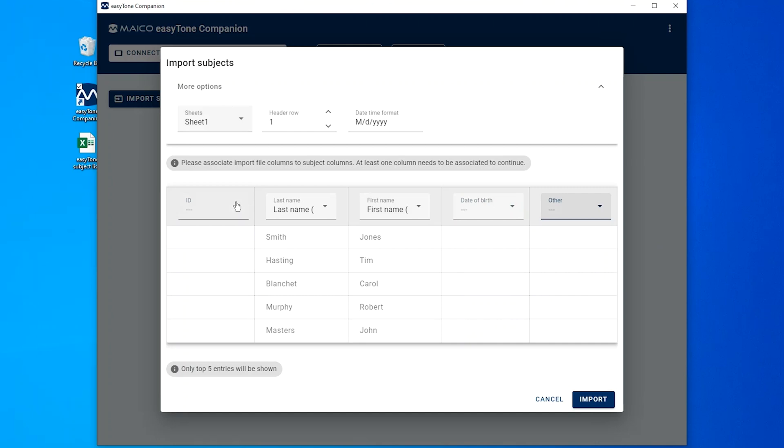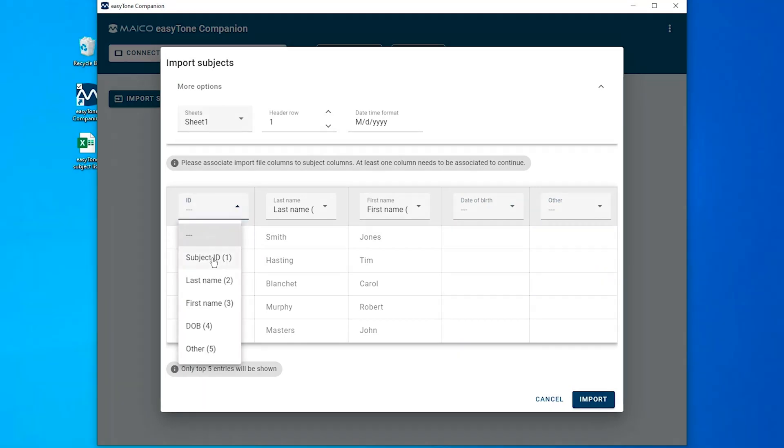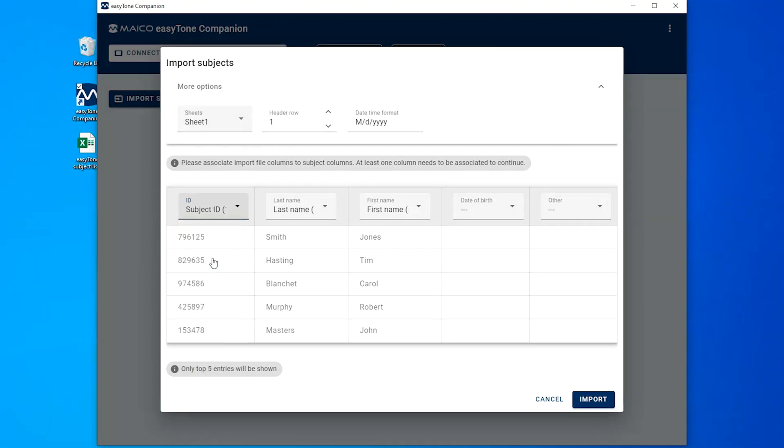For example, the first column name within the easyTone companion software is ID, but the column title within the Excel list is Subject ID. Since this is the correct content for this field, associate for correct population.